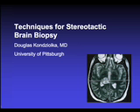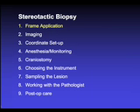In this Congress of Neurological Surgeons presentation, I will focus on techniques for stereotactic brain biopsy. There are many elements of performing a successful stereotactic brain biopsy. We will go through each of these from frame application through imaging, setting up stereotactic coordinates, techniques for anesthesia and monitoring, how to create an opening in the skull, choosing the correct biopsy instruments, sampling the lesion, working with the neuropathologist, and postoperative care.